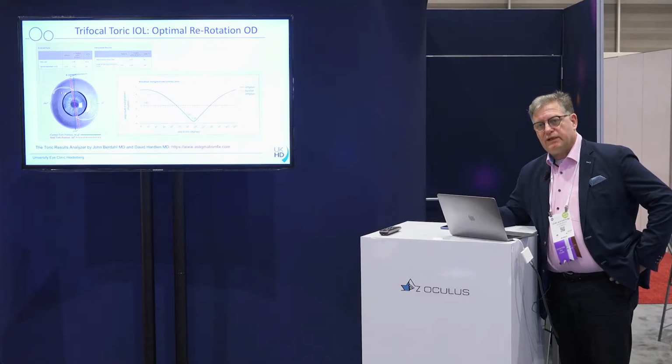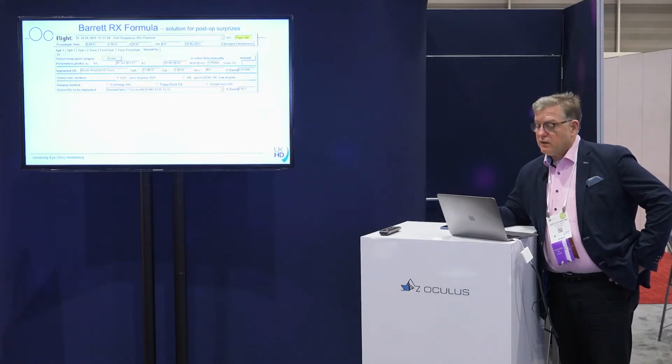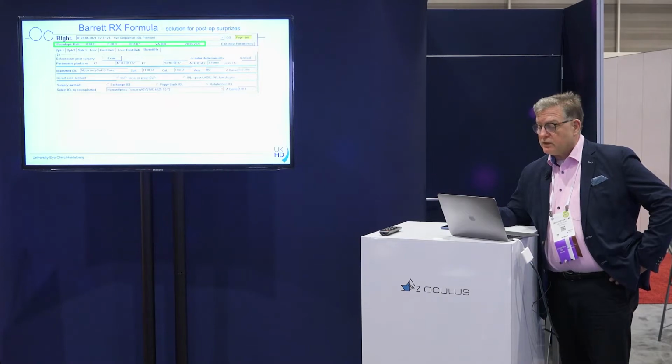But now we also have some features in the Pentacam. In the newest version, there are also some things where you can look at this kind of stuff, use the Barrett formula, and then you can decide if you have a situation like this, if you want to exchange the lens, to piggyback, or if you want to rotate the toric IOL. This is also implemented. You don't need to go to that web page, which we used to do for a while. You just need all these data, which are, of course, automatically inside the program.